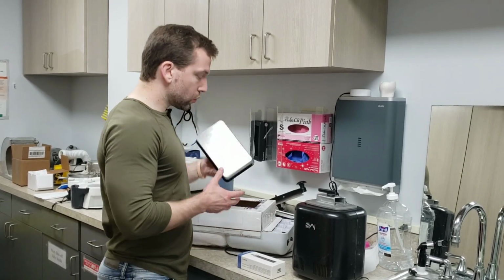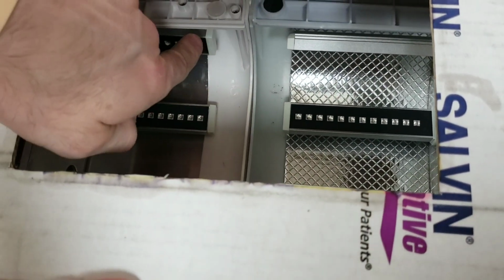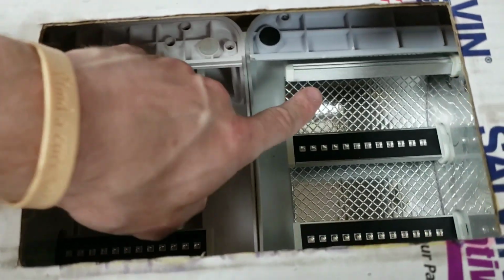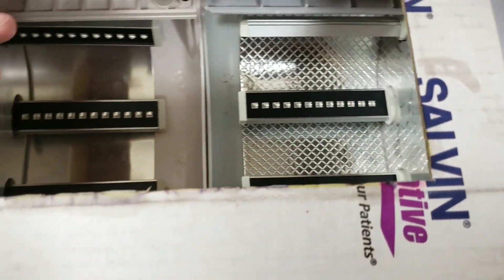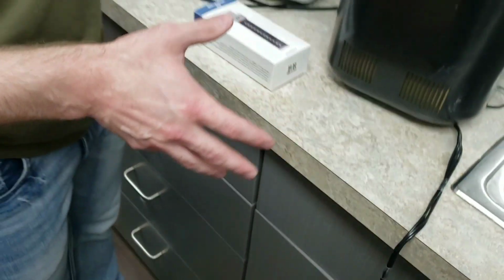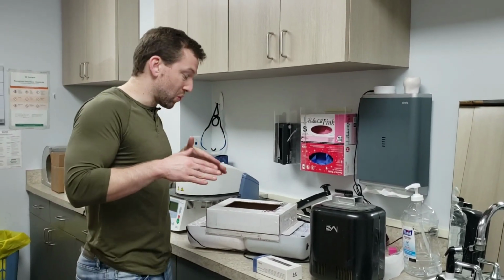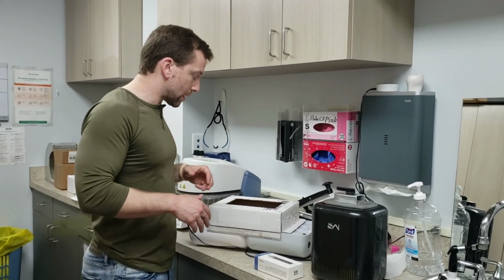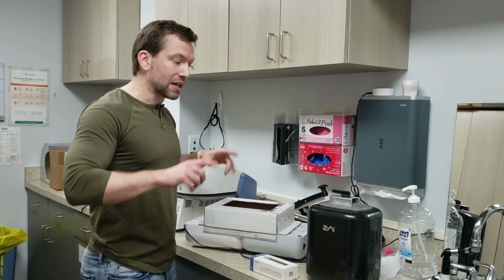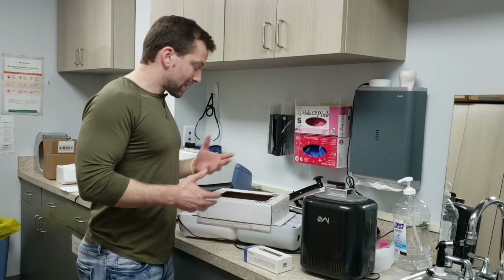And other than that, do notice that if you would come over here for a second, Selena, look right inside this, you will see that this unit on the left actually has them facing the inside, whereas this one's an older one. You can see this is tipped at the wrong angle. I didn't even notice that until I was getting ready to make this video. If you look at my old curing unit, they're all perfectly square. So I'm going to end up replacing that other unit just because I didn't realize that. So there is that one catch. Make sure the UV nail lamp you get doesn't have that turned in. I don't know why they designed it like that, but they did. With their fluorescent bulbs, it probably doesn't matter because they're round and throw the light out in all directions. But anyway, that's just a weird thing I noticed before making the video.